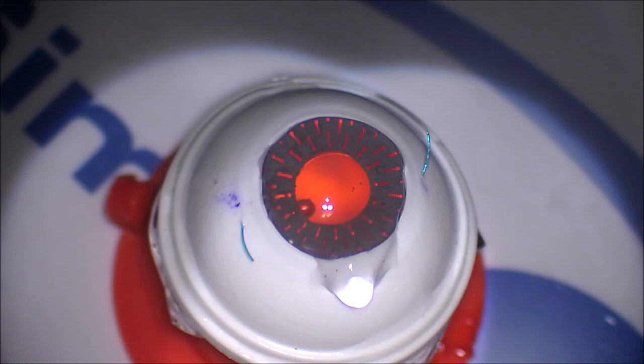So you're going to have to re-cannulate, pull the haptic back into the eye and then tunnel through the sclera again so you get a nice scleral shelf. And when you pull the haptic out, it should look just like this. The haptics are fairly flat with a flat profile along the sclera. And so therefore, you're going to have a very good optic centration with minimal tilt and good axial positioning of the lens relative to the capsular plane.